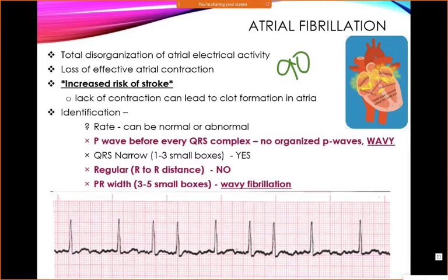P wave before every QRS? Now you could sit here and make a case for P waves if you want. Is that a P wave? Is that a P wave? I don't know. So you're like, I don't really see anything organized. I don't see a nice P wave. So I'm going to just keep going through my checks. My QRS is okay. It's narrow.